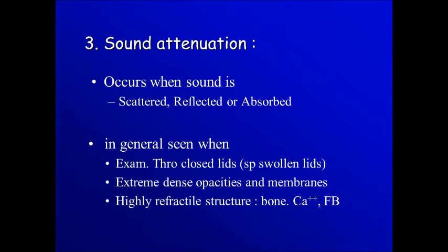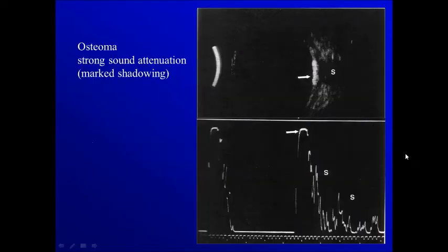The third point is sound attenuation. Sound attenuation occurs when sound is scattered, reflected, or absorbed. We can see sound attenuation if we examine the globe through closed lids, especially if the lids are thick, or if there are extremely dense opacities, membranes, or highly reflective structures like bone, calcification, or foreign body. In this example, this is an osteoma with marked attenuation of the sound, so the area posterior to it appears dark.